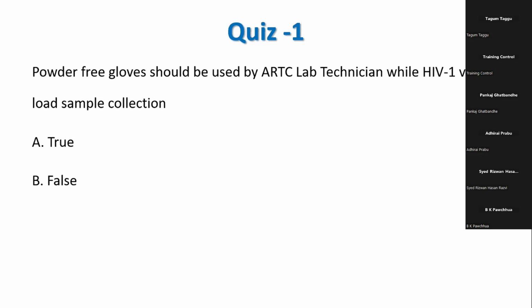So only powder-free gloves should be used. Powder inhibits PCR, and the method we are testing with is PCR. We are detecting RNA copies. So please ensure that you have powder-free gloves in your ART center.